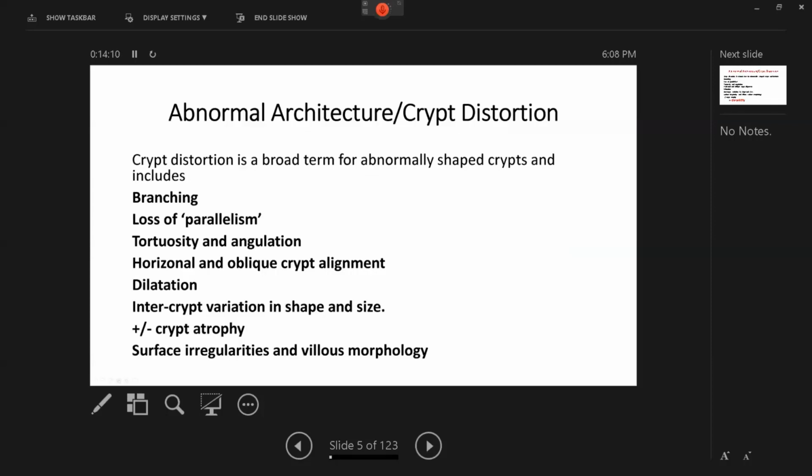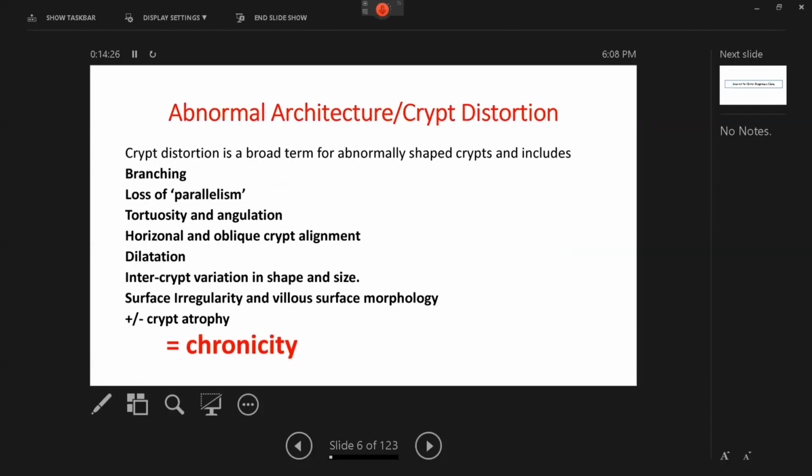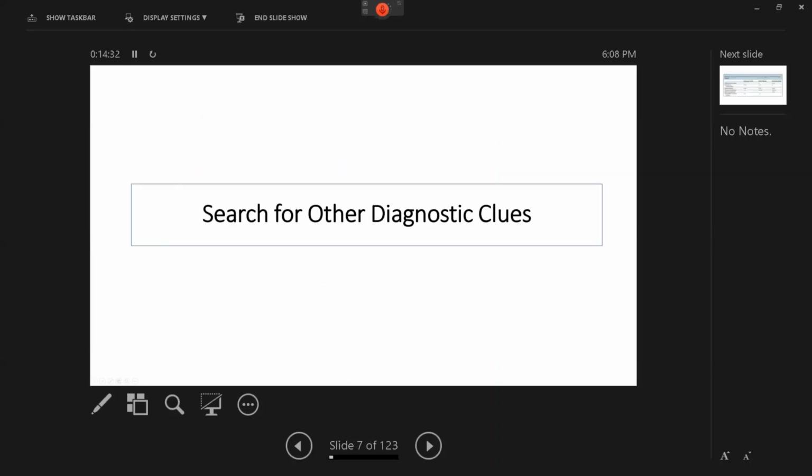And we've paid a lot of attention to the crypt architectural distortion, and we said what it stands for, and each of these features we did discuss in detail, how you recognize it and how you can see it, all in order to be able to put the stamp of chronicity on the case.